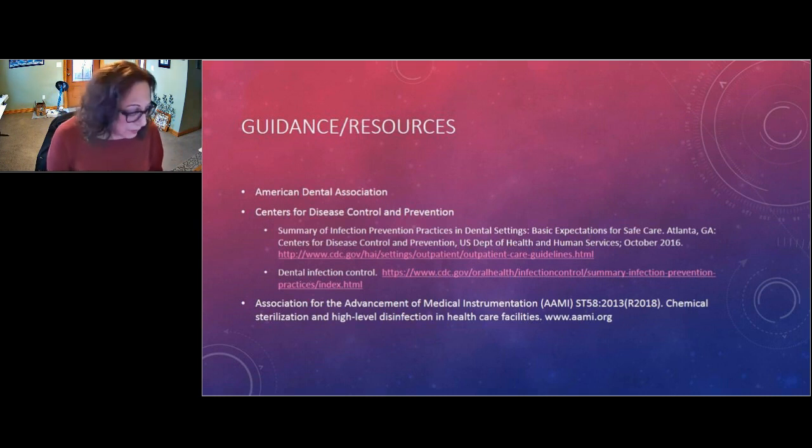And the last thing I want to talk about is, we call it cold chemical sterilization, but is it really sterile? Sterilization is, I think, a bit of a misnomer, because once the item is exposed to the air, it is no longer sterile. So just be aware that if you're using cold chemical sterilization, you are not getting the same level of protection for your patients as you would if you were actually using a steam, dry heat, or chemical vapor sterilizer.